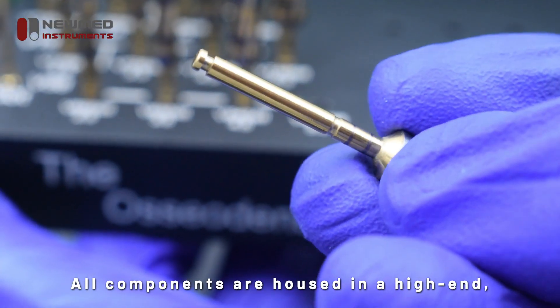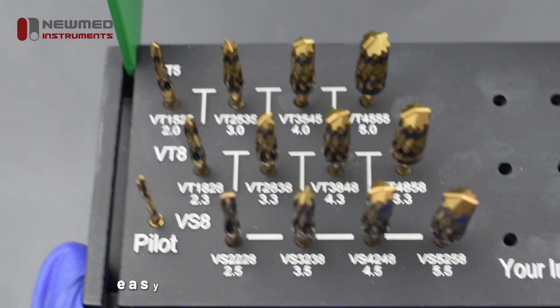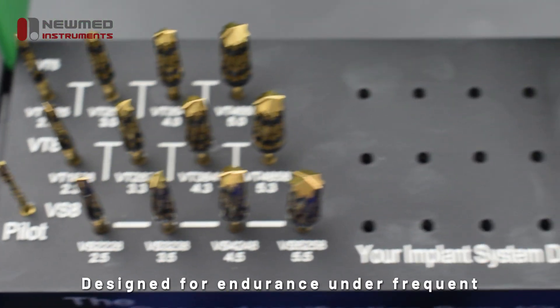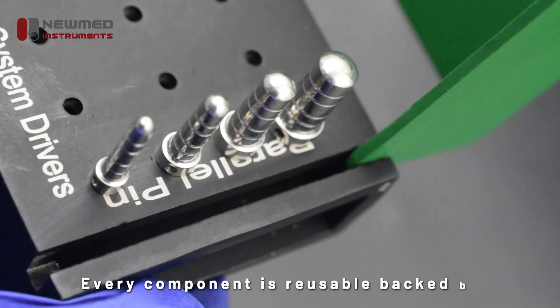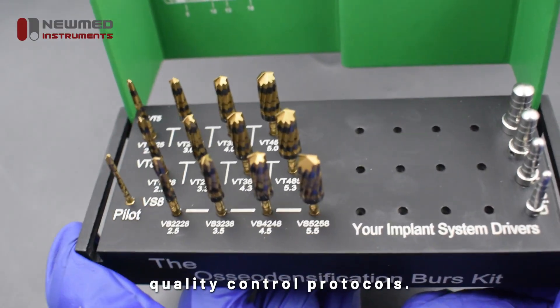All components are housed in a high-end, robust storage kit — perfectly organized for quick access, easy sterilization, and long-term durability. Designed for endurance under frequent sterilization cycles, every component is reusable, backed by Newmed's strict manufacturing standards and quality control protocols.